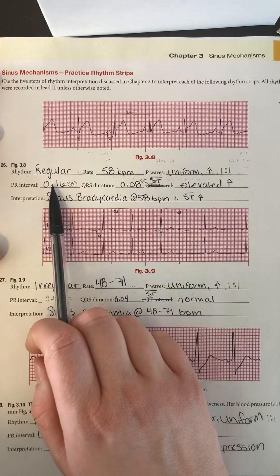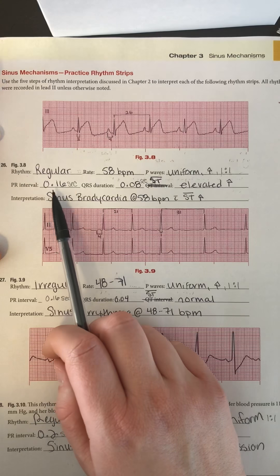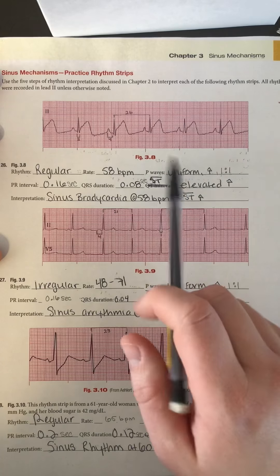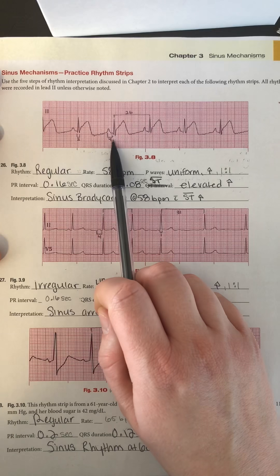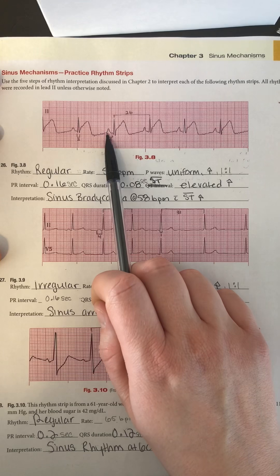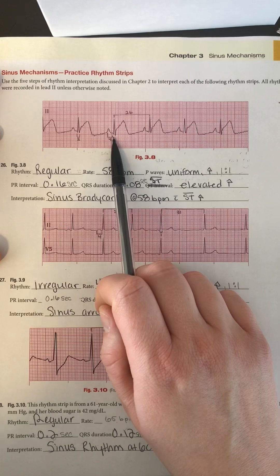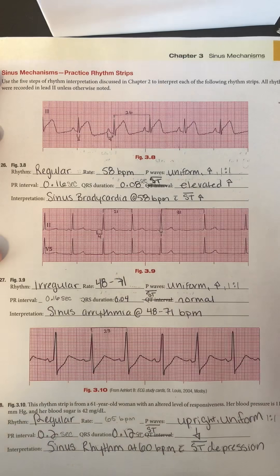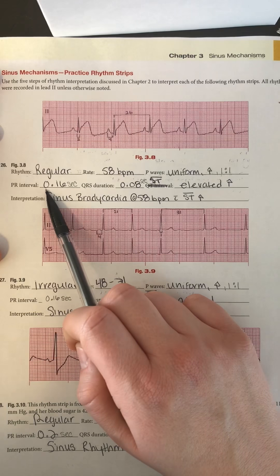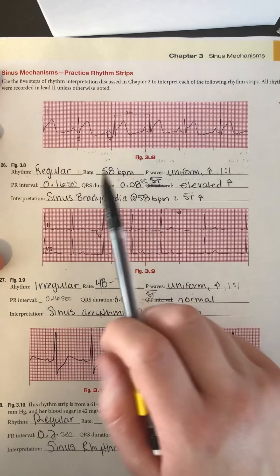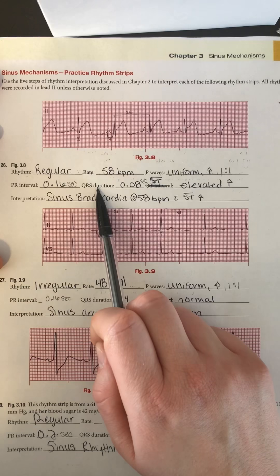Next we'll look at the PR interval. With sinus mechanisms we want it between 0.12 and 0.20 seconds — that's normal. I found a P wave and QRS complex that lined up well with the boxes. I marked from where the P wave starts to where the QRS complex starts, and got four small boxes across. Four small boxes equals 0.16 seconds, because one small box is 0.04 seconds.